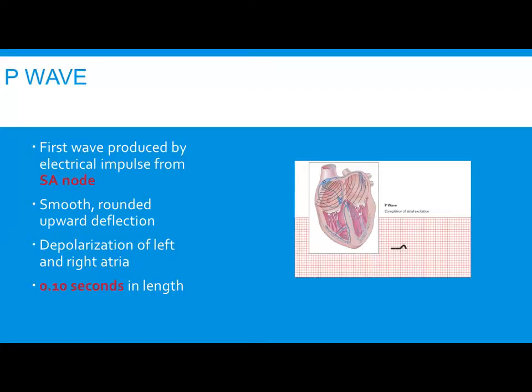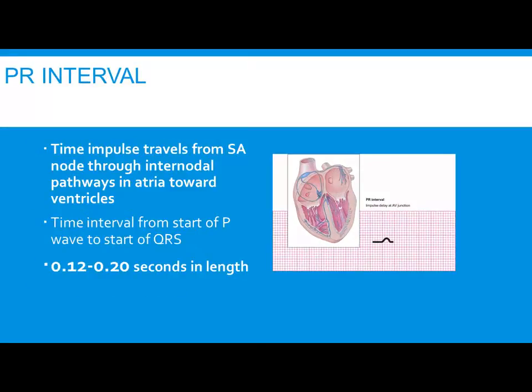seconds in length. How many small boxes would that be? 2.5. It would be 2.5 small boxes. All right? Don't worry about that as much as this.